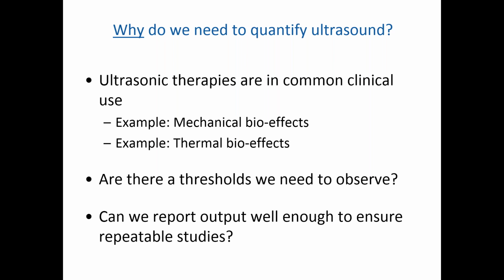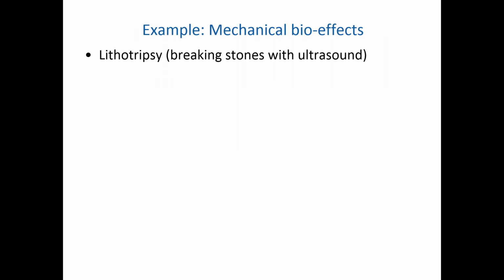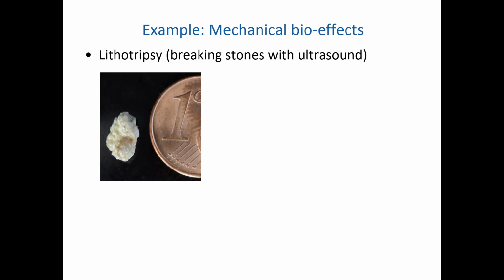So let's start with the first of those. I'm going to start by talking about the technique of lithotripsy. Lithotripsy is where we're using highly focused ultrasound to break stones. An example of one of the Creative Commons images here is of not a typical stone.